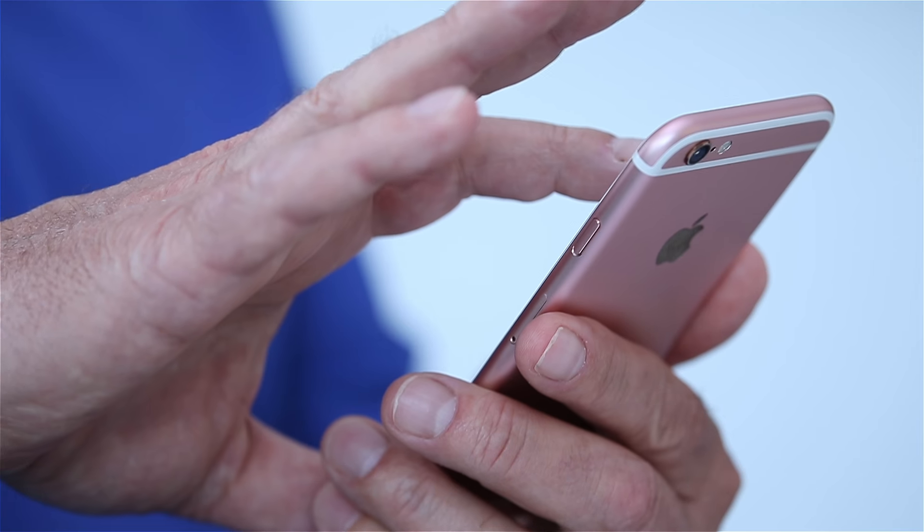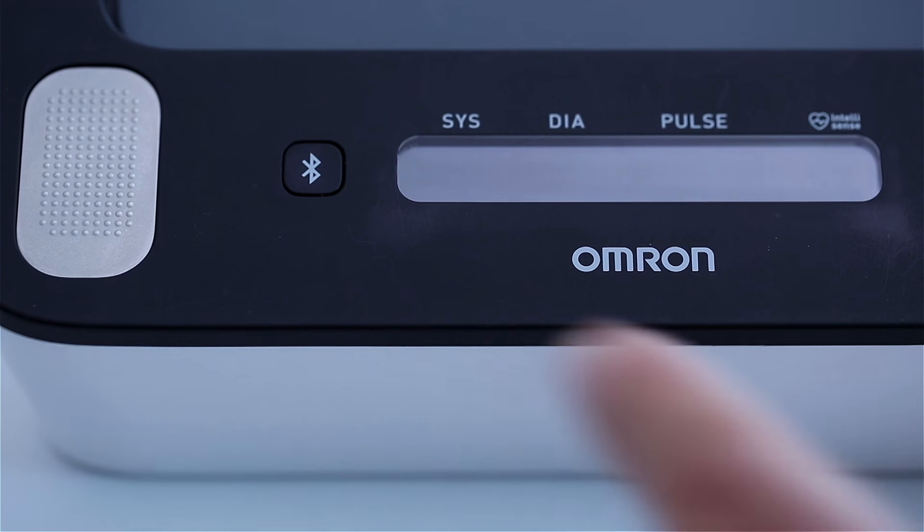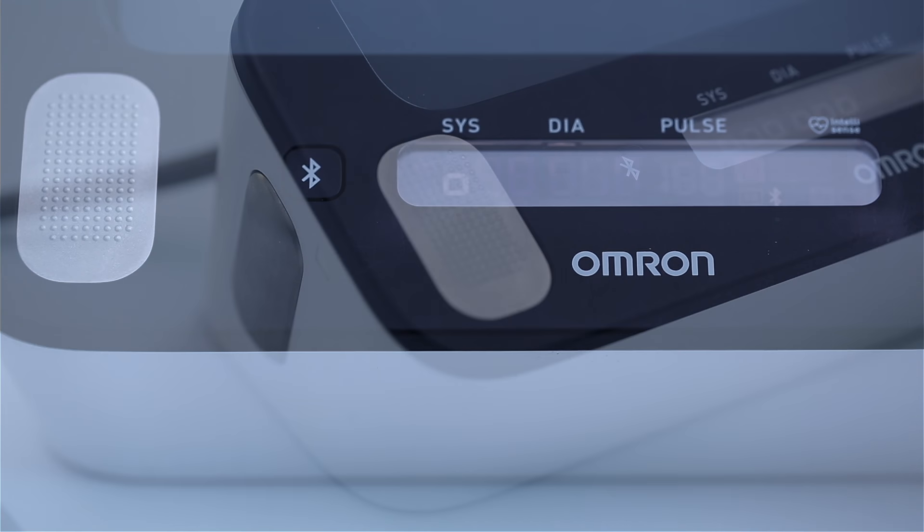Step 2. Download the free Omron Connect US CAN app from the App or Google Play Store. Step 3. Enable Bluetooth on your smartphone and open the app, following instructions for pairing.